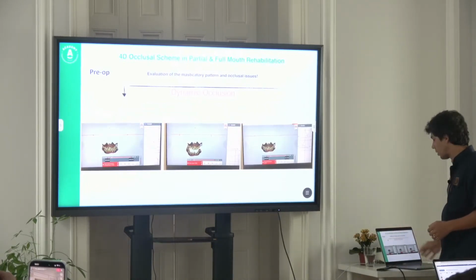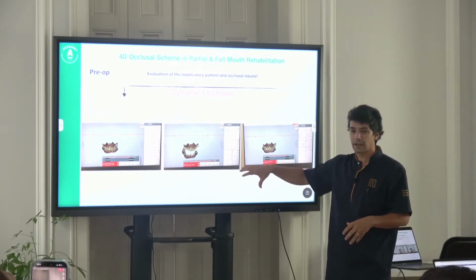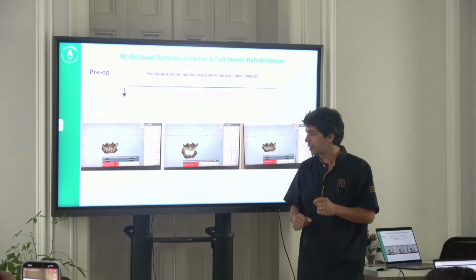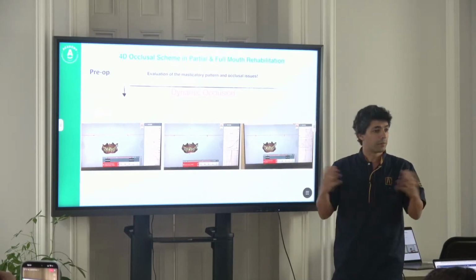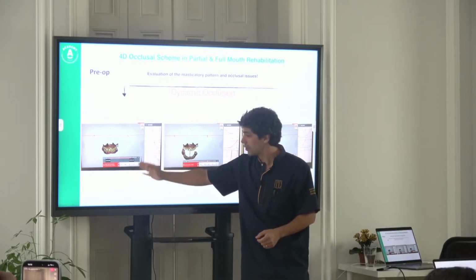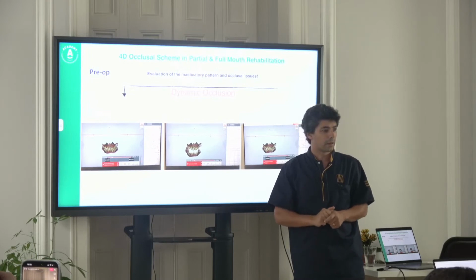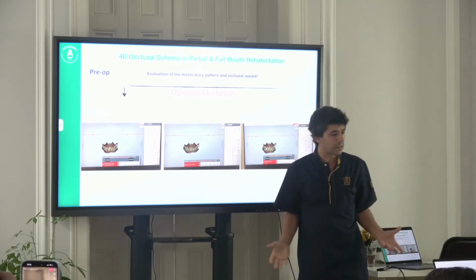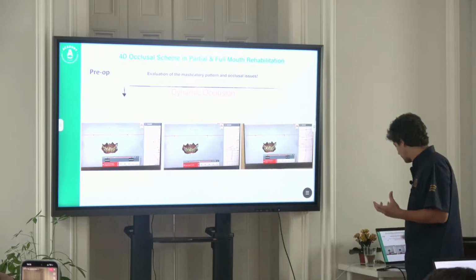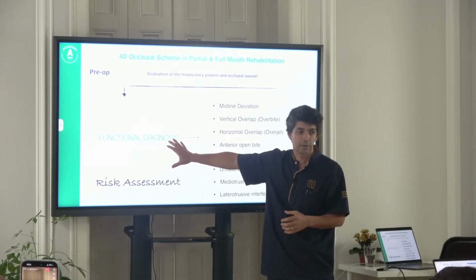This being said, we have to check the case not only if the patient is fully dentate, but also in a fully edentulous patient. And here, as you can see, we check the lateral movements as well as the opening and closing and the centric relation. And we try to find what in fact is crucial, which is a functional diagnosis.